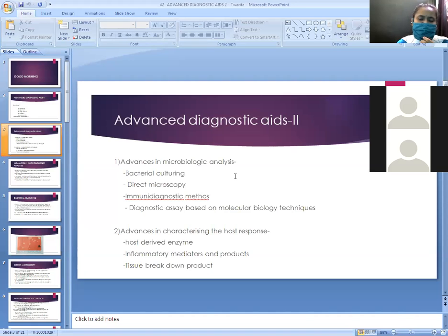When you are going to take the next radiograph, the same bite record is useful, and the same extension arm, so that bite record will help you record the next radiograph also. So radiographs can be taken sequentially at every visit. For the first visit you take a radiograph, at the second visit you again take one by maintaining proper position. These 2-3 sequential radiographs are superimposed over each other, meaning kept over each other.